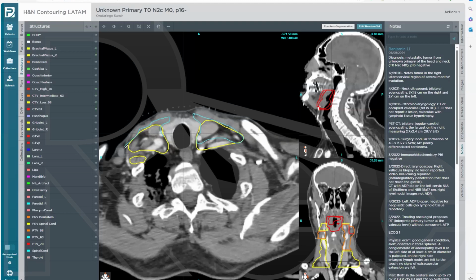Dr. Patel, someone is asking, how much margin should we use from GTV node? Margin for gross disease. So have you had any discussion, I don't know, in the lectures about 5+5? The 5 mm margin expansion and gross disease. You have talked a little bit, but maybe it would be better if you review, because not all who are in this session. Okay. Yes.